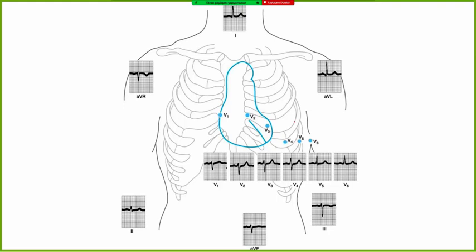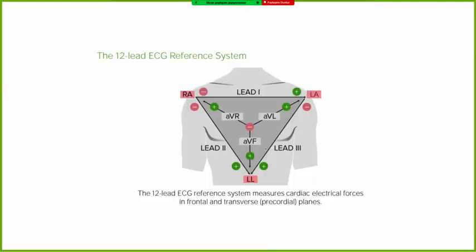And this is all of the ECG recordings that we talked about. D1, D2, and D3 are the bipolar derivations. AVR, AVL, AVF are the unipolar derivations, as are V1 through V6. And the morphology of the ECG wave changes in every derivation since the placement of the positive electrode changes in every derivation.